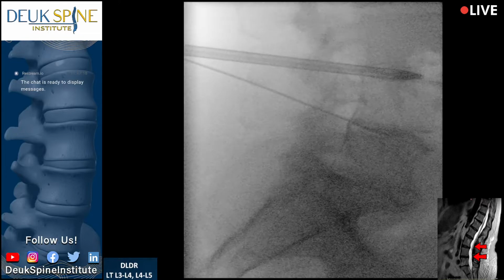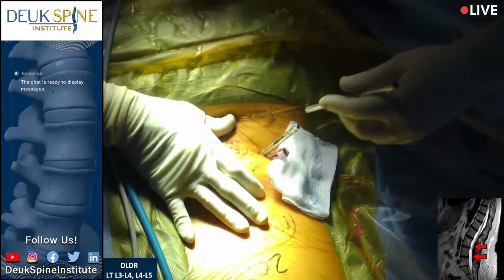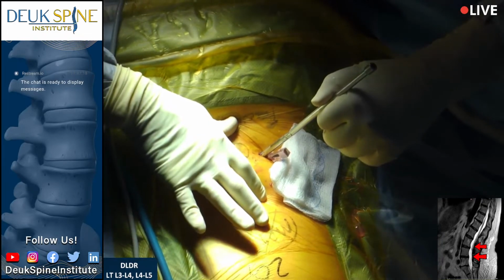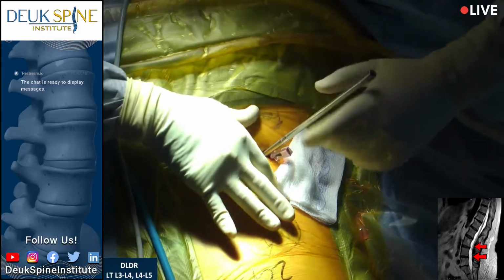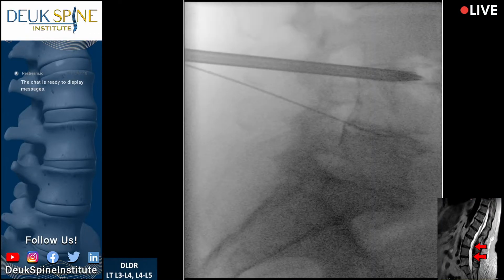Anesthesia is good, but it's also dangerous. Anytime we do anesthesia, there's a risk that the patient will go to sleep too much, stop breathing. We don't want that. So you want to keep them light enough that they're safe from a breathing standpoint, but deep enough that they're not writhing in pain. So using a local painkiller can be very helpful. And we've used local on the skin, which you saw us do. And we used local also inside the disc with the discogram.